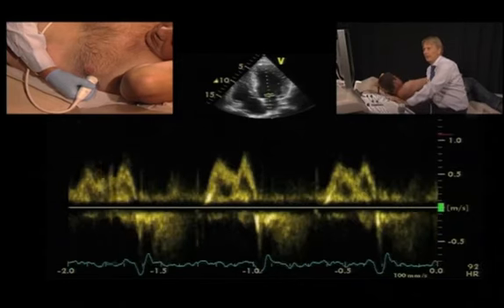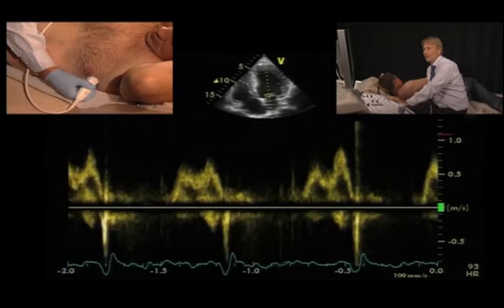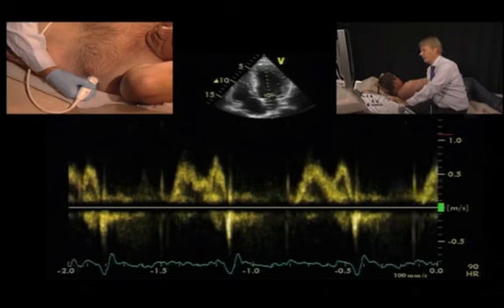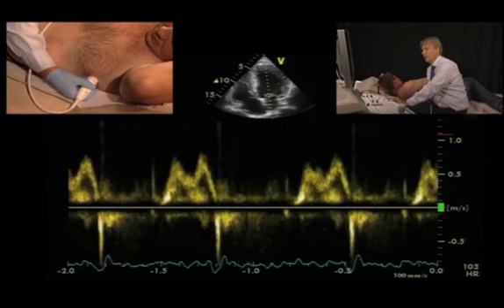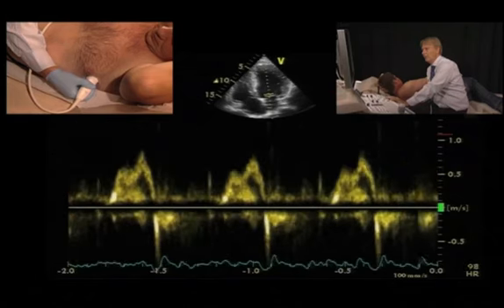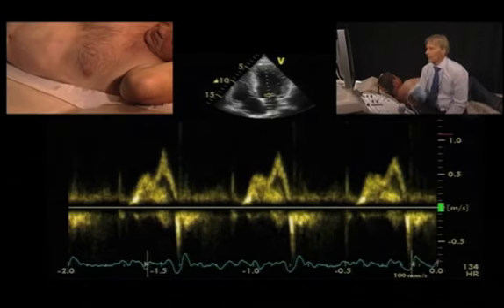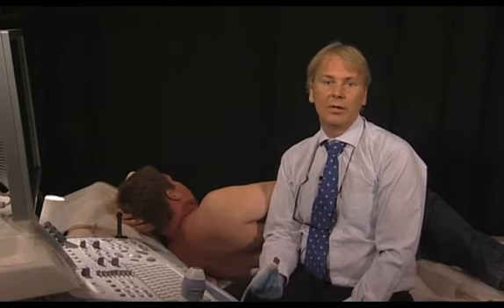Okay, so we see, again, E and A are about the same size. Now let's let him press, do the Valsalva maneuver. And see, with the Valsalva maneuver, the A wave increases even more. Here we go. And all of a sudden, we have a relaxation pattern, thereby demasking the pseudonormal pattern and showing that the patient does not have a normal but an elevated left atrial filling pressure.